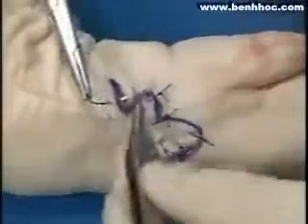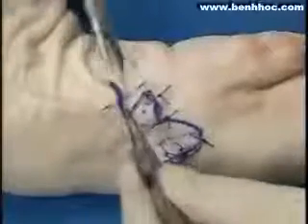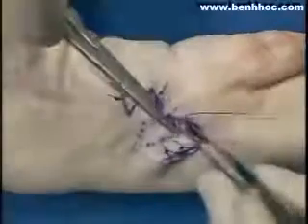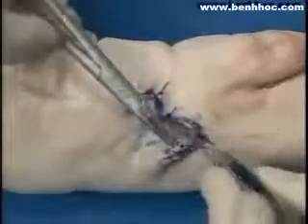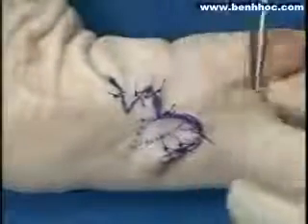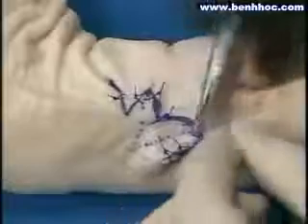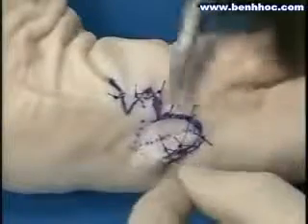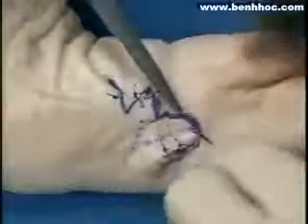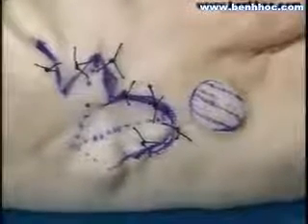We use the remainder of the sutures to be placed according to the principles of halving. If any dog ears occur, again, we remove a dog ear by placing a hook at the apex of the dog ear or standing cone, and then use a back cut away from the flap and trim that tissue to allow the flap to be closed. Here we see the circular lesion removed and the first and second flap in position.